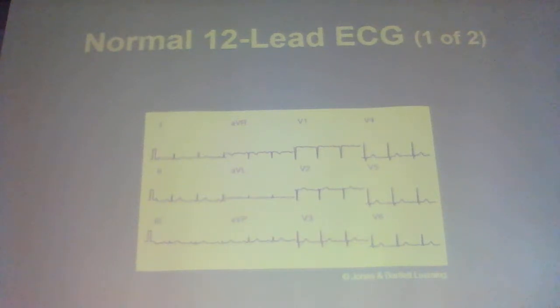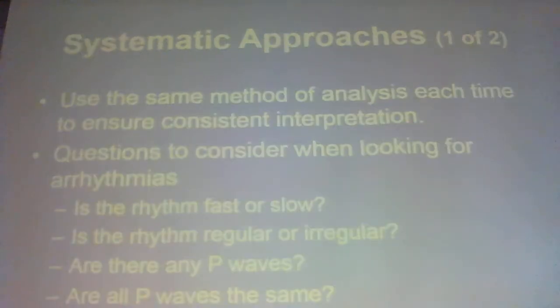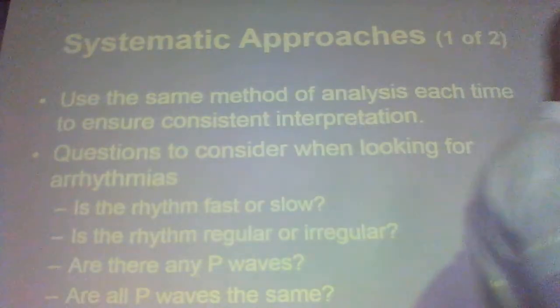All right. So this is what? Normal 12 lead, right? See anything in there weird? Everything looks good. All right, so we need to look at every 12 lead the same way. That way we don't miss anything.